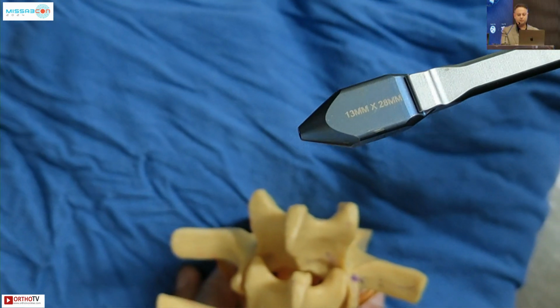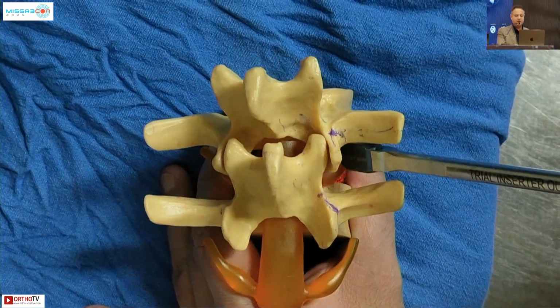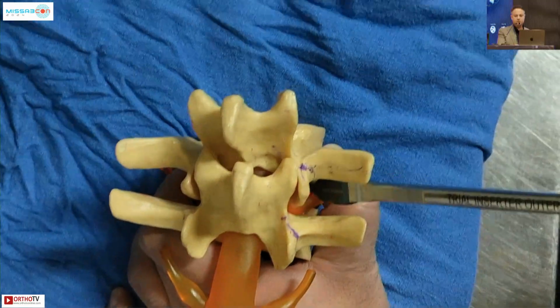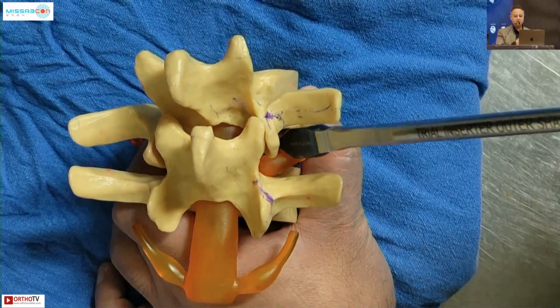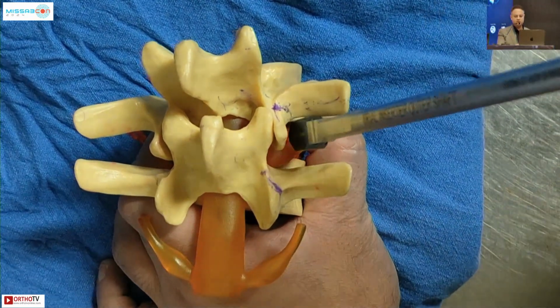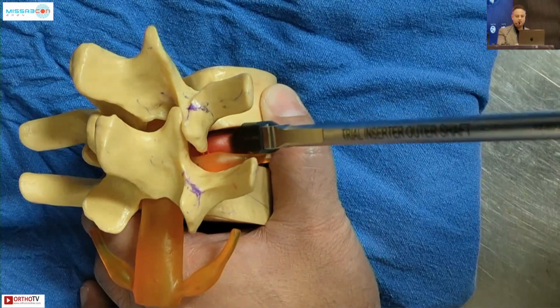So I just made a small video of a model to see how this specially designed cage with a tapered nose, as it goes through the Kambin's triangle, it just pushes the exiting root out of the way, and as it goes, it just distracts the disc space and the exiting root moves away. So it goes in quite well, and the trick is to spend the least amount of time with a big device in that Kambin's triangle.